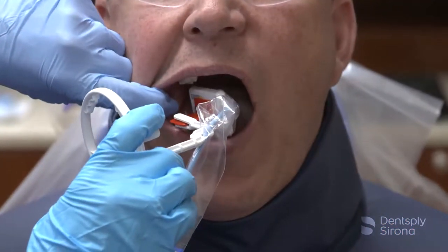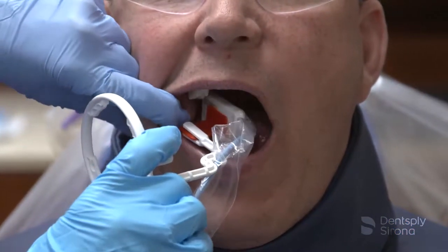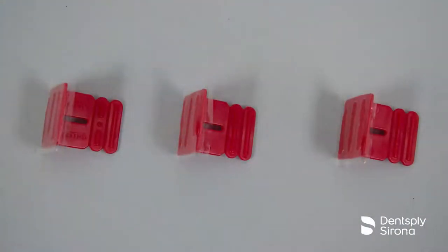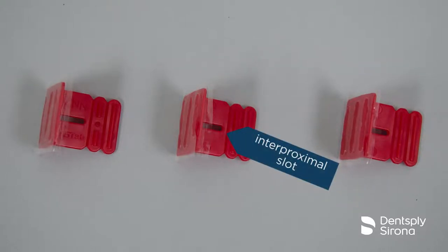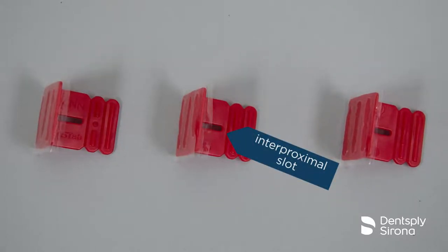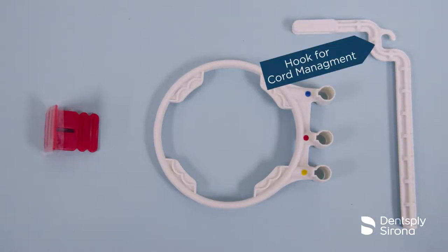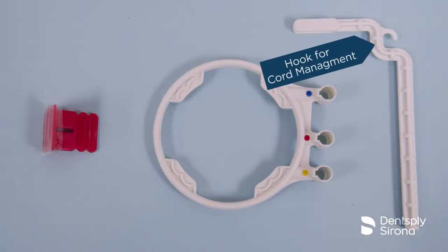the FastTab bitewing holder has a permanent adhesive to keep the holder from moving or separating from the sensor during the procedure, is molded with an interproximal slot designed to help prevent overlap, and is available with an optional positioning arm and ring to accurately align the x-ray cone with the FastTab bitewing holder.